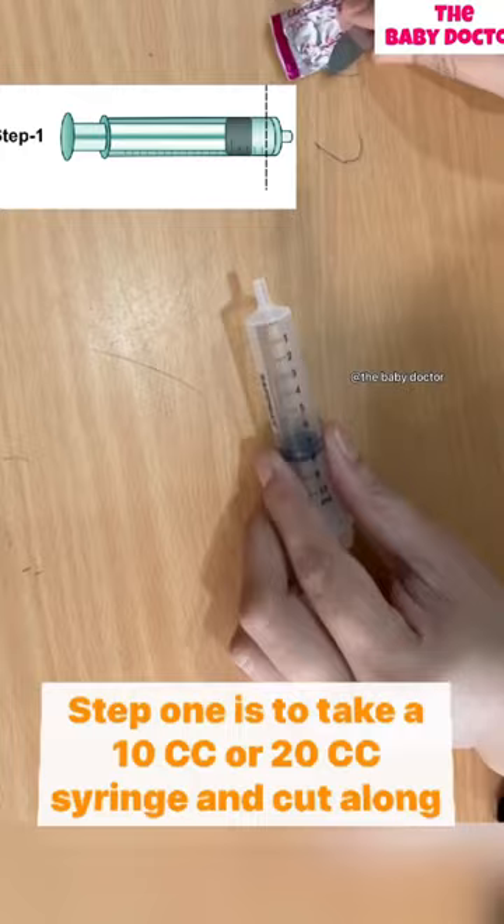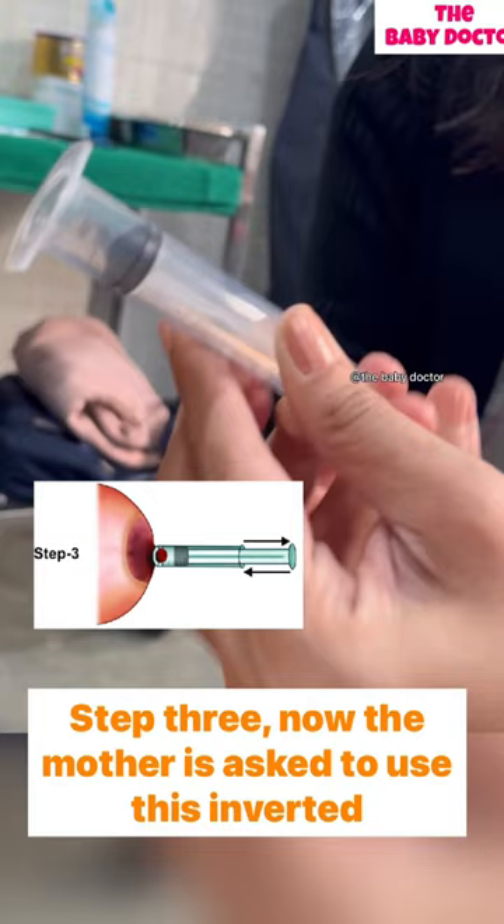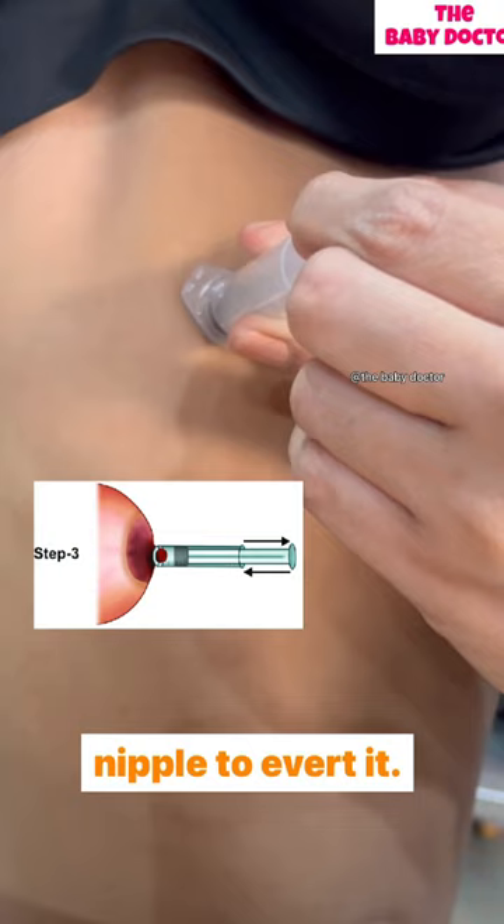Step 2: remove the plunger from its original place and insert it from the cut end. Step 3: the mother is asked to use this inverted syringe and apply a gentle negative pressure around the nipple to evert it. This procedure can be repeated before each breastfeed for as long as required.